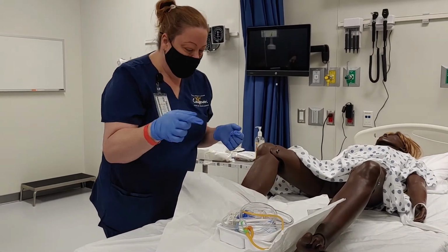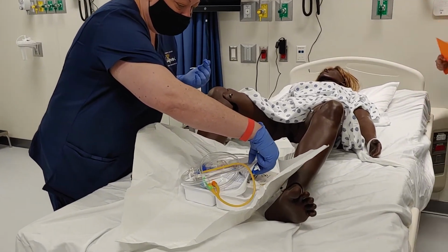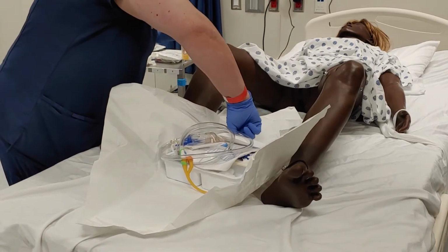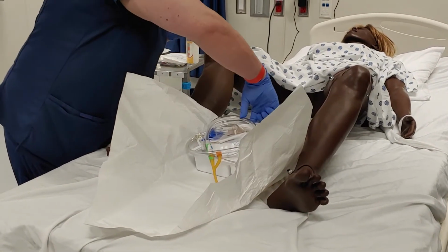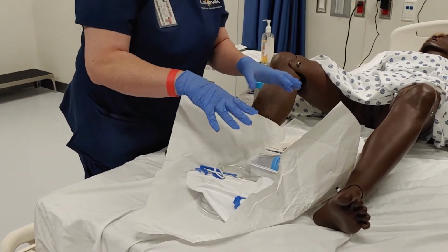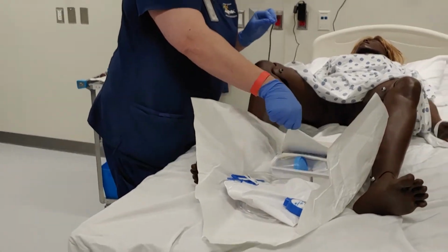Yeah. All right, so I'm going to very carefully pick up this portion that does not have to be sterile. I'm going to scoop this over here to the end, and I'm going to set this out here inside my sterile field, okay? Once I have that, I need to go ahead and get these drapes out.